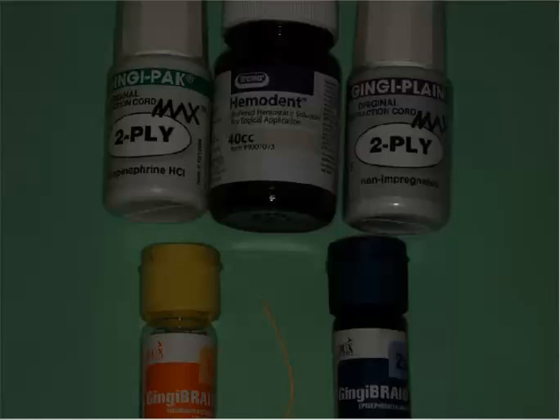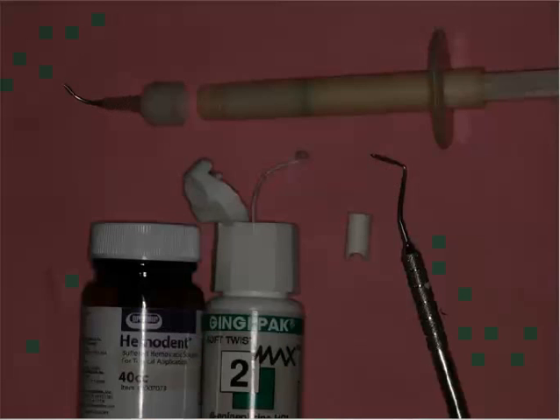There's no precipitate formed. It's a very clean material as long as we don't have excessive amounts present, and it really allows us the shrinkage of the blood vessels and the tissue to help us get an opening in the sulcular area. And this is really what I utilize most of the time when it comes to taking impressions. We have our Hemident here, the aluminum chloride. We have our non-woven #2 cord with epinephrine impregnated.